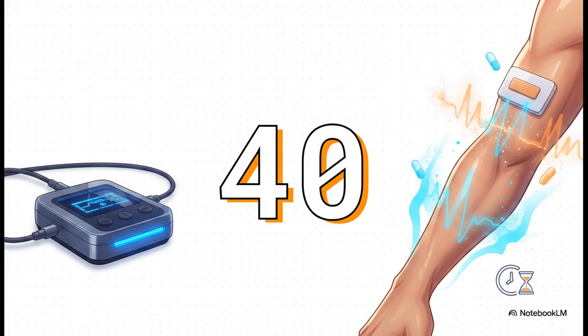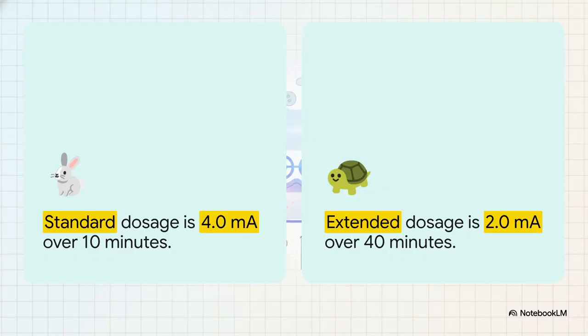Now, the standard target dosage we generally use as our clinical baseline is 40 milliampere minutes. This is basically the sweet spot for getting an effective amount of medication in there while keeping the treatment time pretty reasonable for a standard outpatient visit. But here is where your clinical judgment really kicks in. A standard treatment might be, say, 4.0 milliamps delivered over 10 minutes, which hits our 40 milliamp minute dose perfectly.